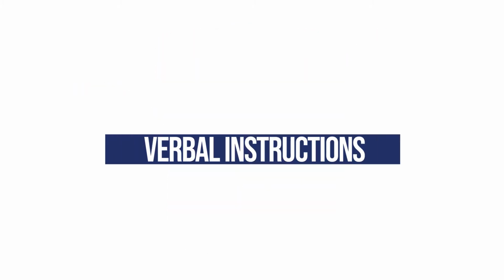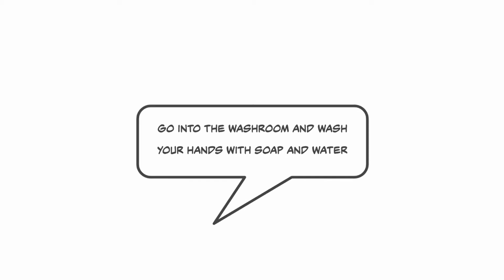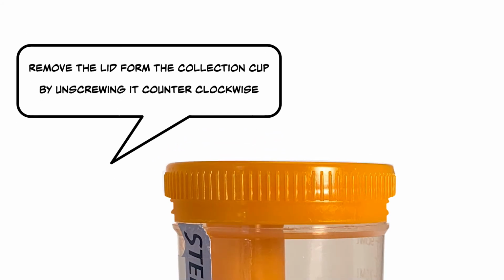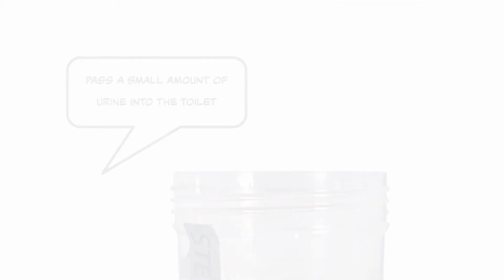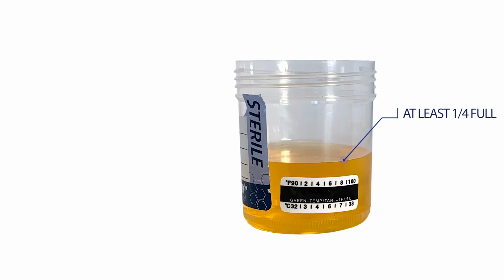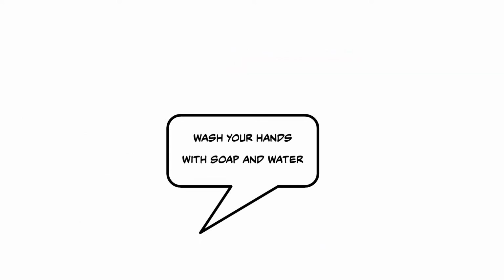Provide the following verbal instructions to the patient on how to collect a midstream, clean-catch urine specimen. Go into the washroom and wash your hands with soap and water. Dry your hands with a paper towel. Remove the lid from the collection cup by unscrewing it counterclockwise. Pass a small amount of urine into the toilet. Pass urine into the collection cup until it is at least 1/4 full. Screw the lid back onto the collection cup until it clicks, and wash your hands with soap and water.